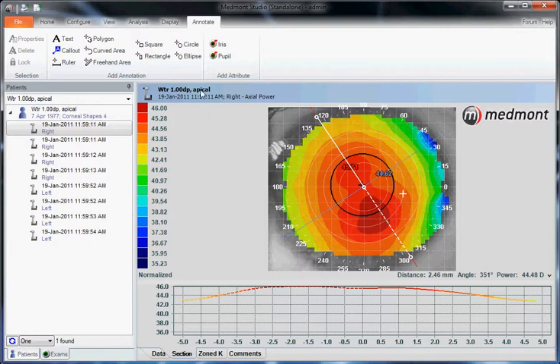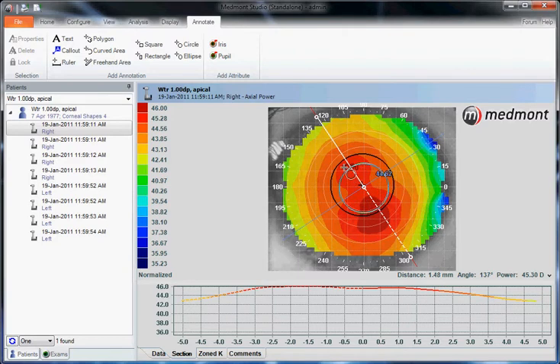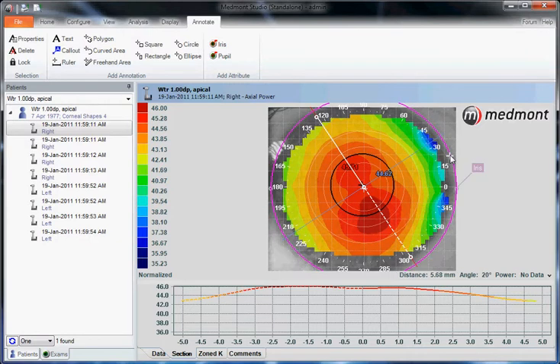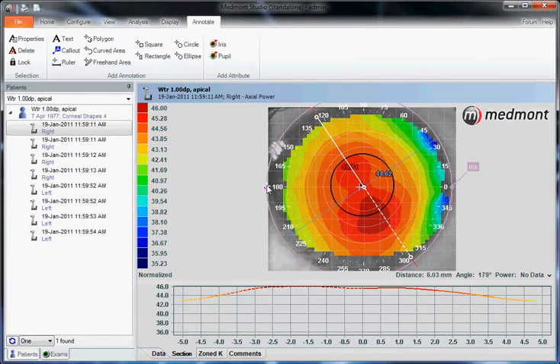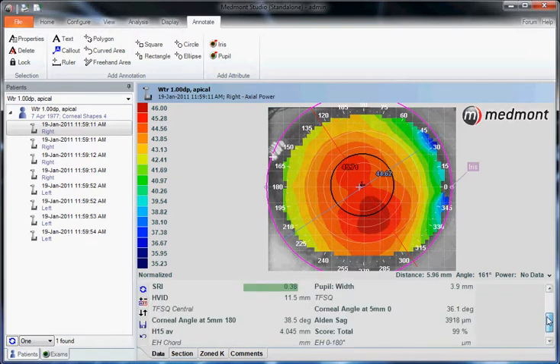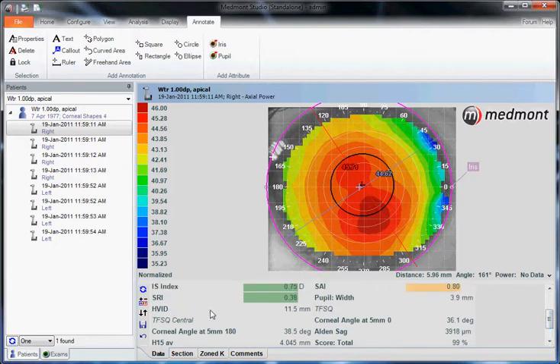One of the other tools you may use more commonly is the iris function. This allows us to click our cursor in the center, pull the circle out to the approximate diameter of the visible iris, then move that circle over top of what we believe is the visible iris scleral border and release. Then when you go down to data, you'll notice that the visible iris diameter will populate — HVID, horizontal visible iris, 11.5 millimeters.